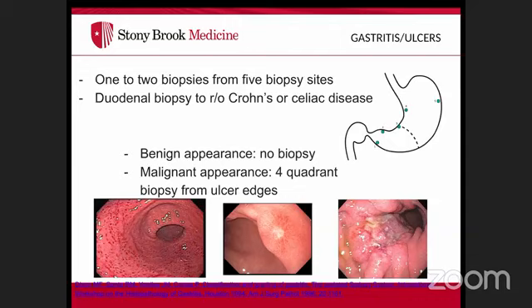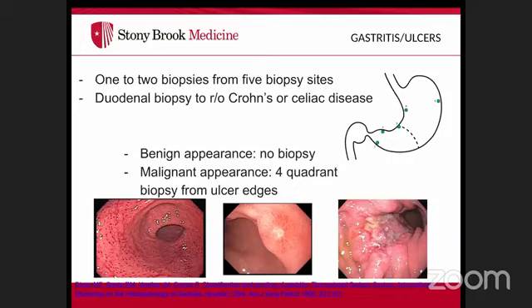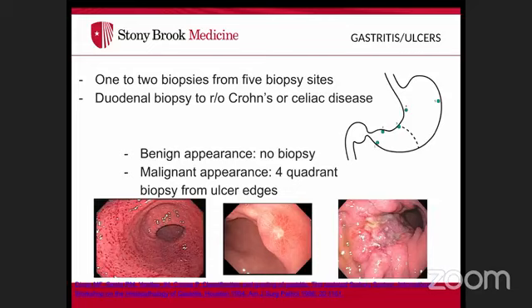Also consider duodenal biopsies to rule out Crohn's or celiac disease, and send specimens for H. pylori testing. For ulcers, biopsy approach depends on appearance. A benign ulcer has smooth, regular, rounded edges with a flat base filled with exudate. A malignant-appearing ulcer has irregular edges and central protrusion and requires four-quadrant biopsies from the ulcer margins.